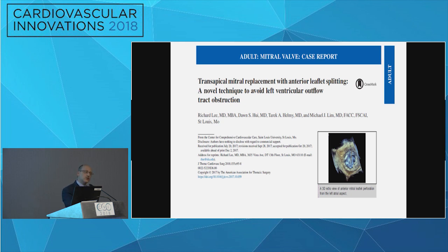And then when you get in the anterior leaflet, in one case we were too basal, too close to the annulus. So we had to withdraw and move a little anteriorly. It's not 100%. Again, with the LAMPOON, you see the diagrams and the images, it's not 100%. You get close enough to where you actually have purchase on the leaflet, and then you perform your procedure. The purpose here is to minimize LVOT obstruction. It's not plastic surgery, so you want to get a good result. Congratulations. Thank you. Go ahead, sir.